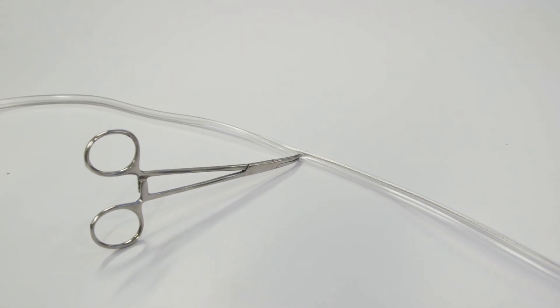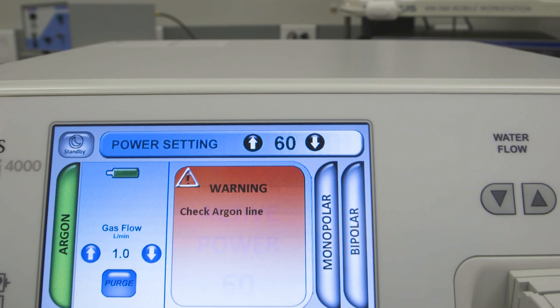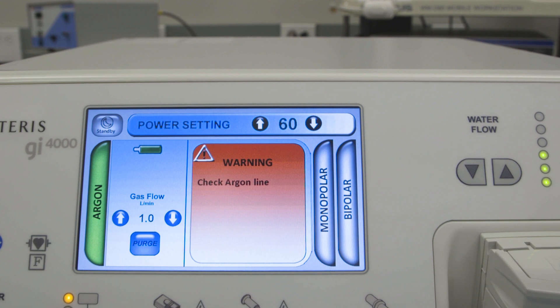The GI-4000 will sense pressure building in the argon tube set and trigger the warning when argon line pressure has exceeded the threshold set by the manufacturer.